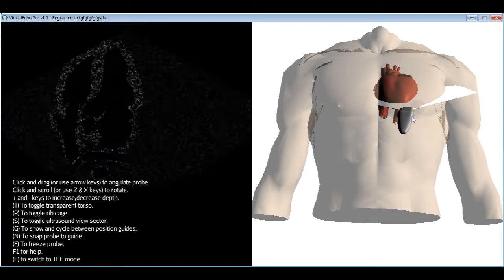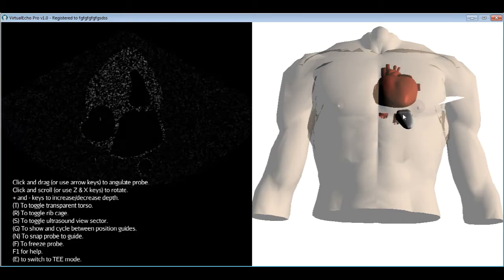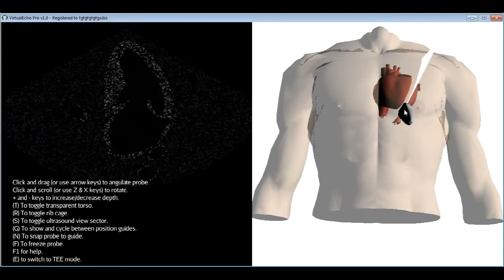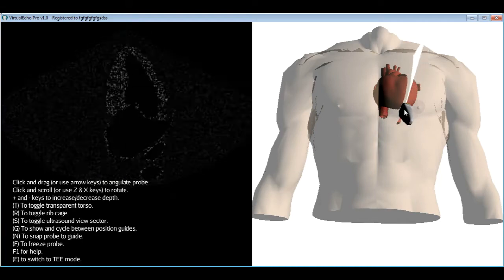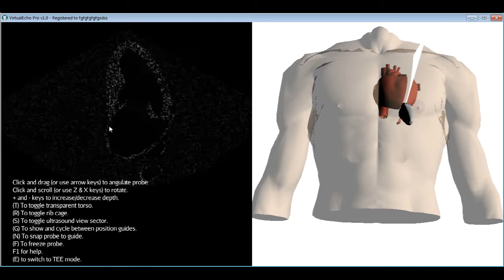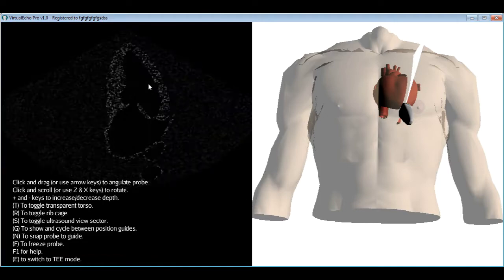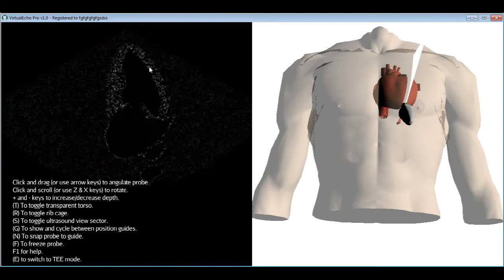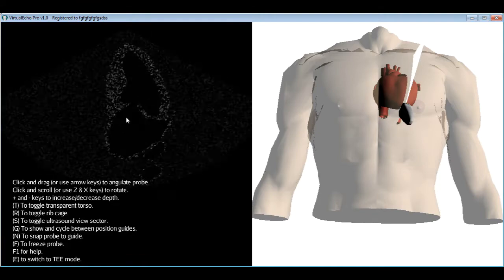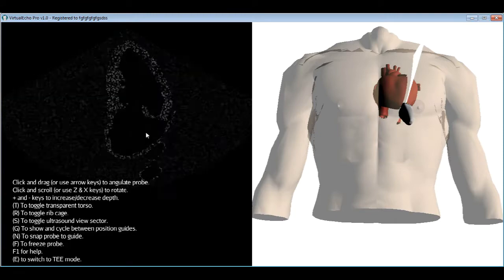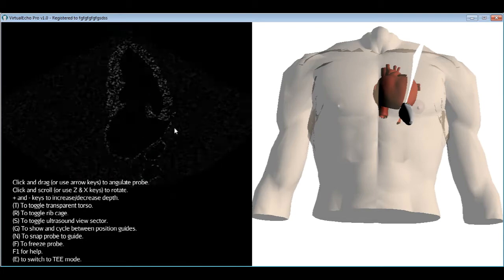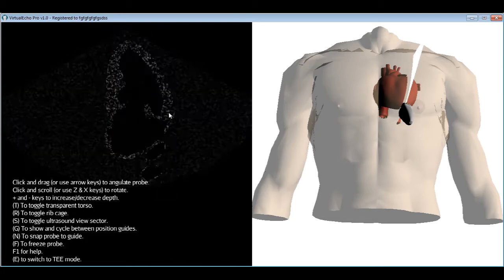The apical two chamber view is obtained from the four chamber position by rotating the probe so the knob becomes more vertical, allowing visualization of only the left ventricle and atrium. This view is useful for assessing the anterior and inferior LV segments and the mitral valve for eccentric mitral regurgitation not visible in the four chamber view. It is also one of the few transthoracic echo views that can image the left atrial appendage for the presence of a thrombus.